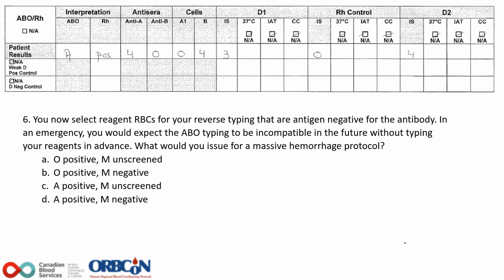So now back to our original question. We had an ABO discrepancy, and the most likely reason why we had a discrepancy was that the red cell that we were using that was an A1 likely expressed the M antigen, and the person had an anti-M. Therefore, we're getting that reactivity in this particular cell for the reverse typing.